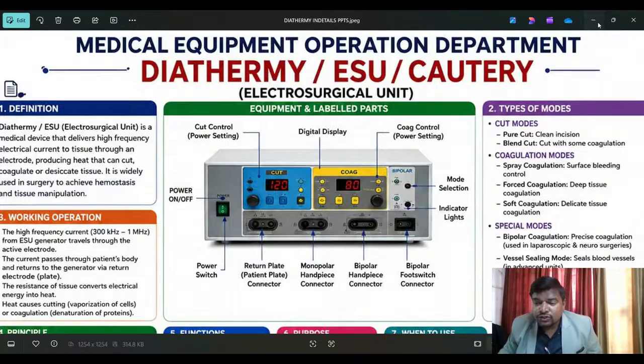And then what we should do, sir, about these things? On a regular basis, connect the UPS. As a biomedical engineer, you have to instruct the doctors and technicians who operate the equipment. First thing is whether power supply is coming and whether it is connected to the UPS, for protection purposes. Next thing is whether all accessories are connected and everything is fine, you have to check it.